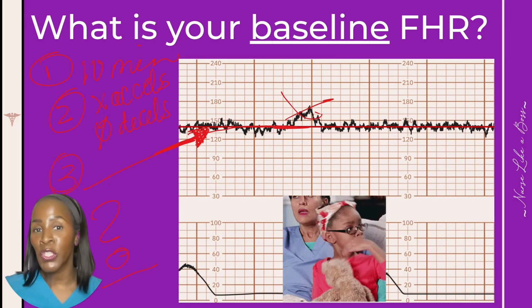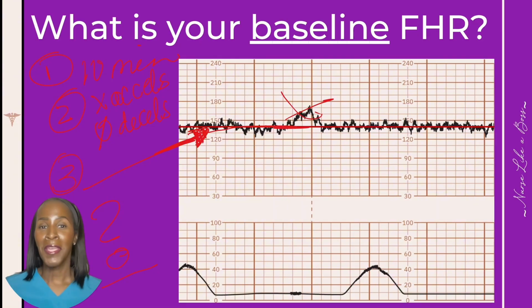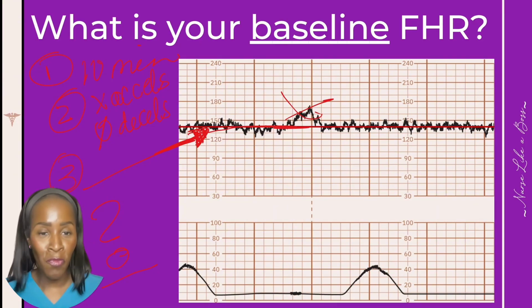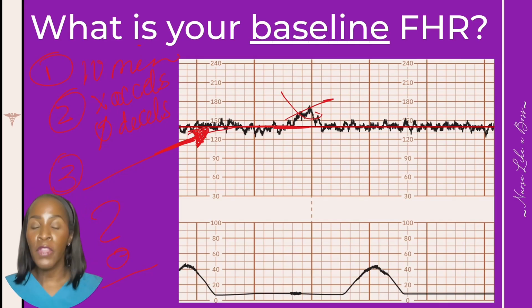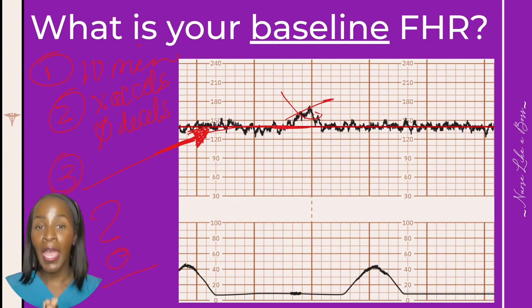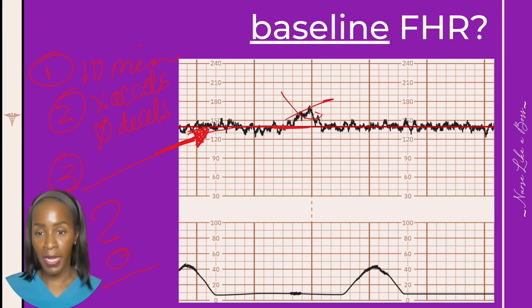No one's going to come to you and say, you got that wrong. If you see 145, it's around there, right? But it isn't like 120 and it's not 160, right? If you said any of those, that would be incorrect. And I wouldn't expect a test that you take to hover so close together. I would expect them to give you something that's a very obviously wrong answer and something that is right.